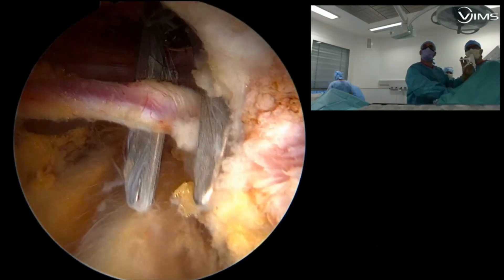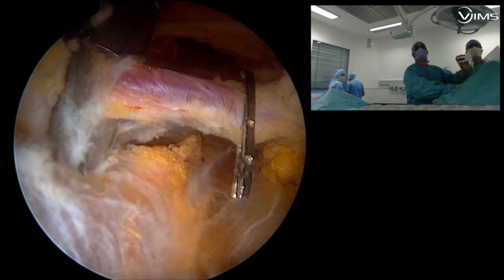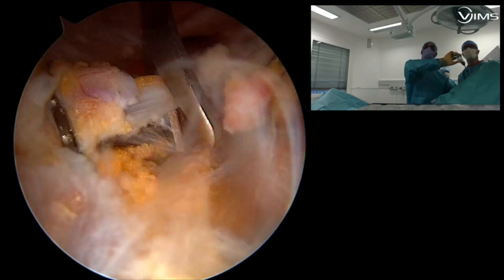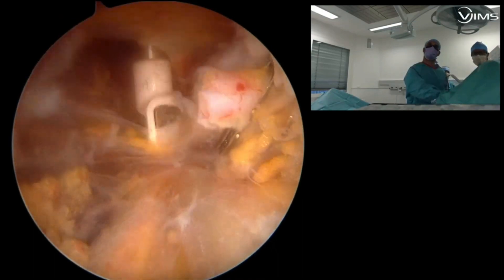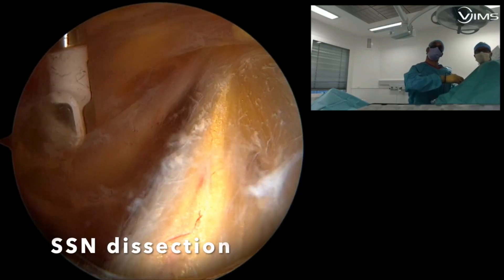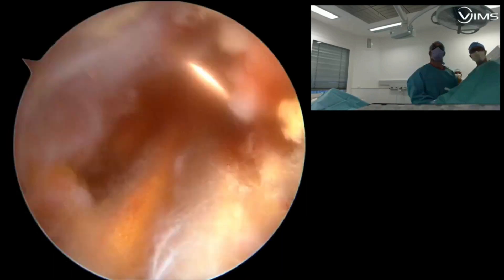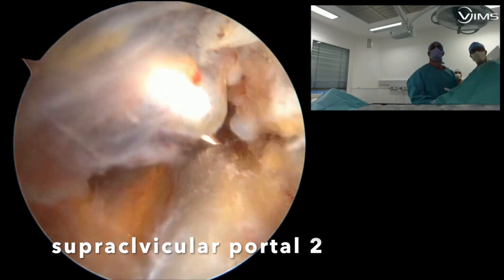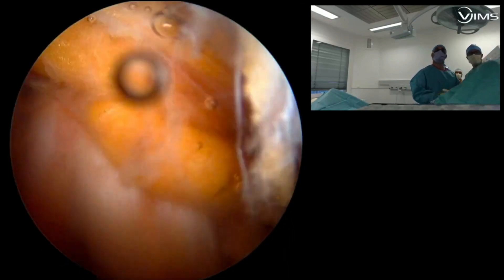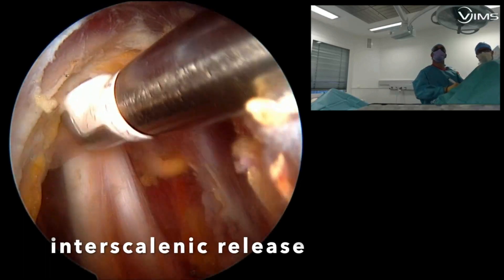I prefer to ligate the transverse cervical vessels because I'm afraid to damage them while I continue my dissection. Still using the endoscopic scissors, I cut the transverse cervical vessels and move on to releasing the interscalenic plexus, complete the dissection of the suprascapular nerve, and then move more proximal, perform a second supraclavicular portal, and continue the dissection between the scalene muscles.